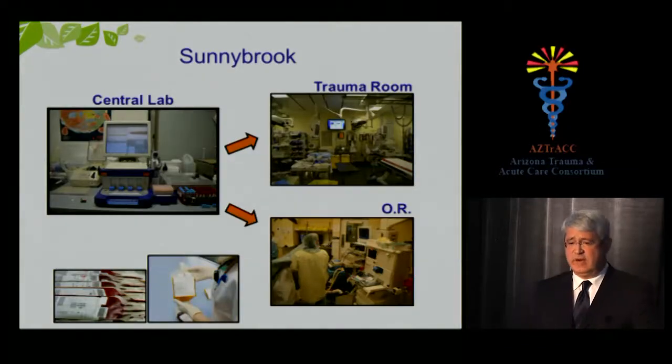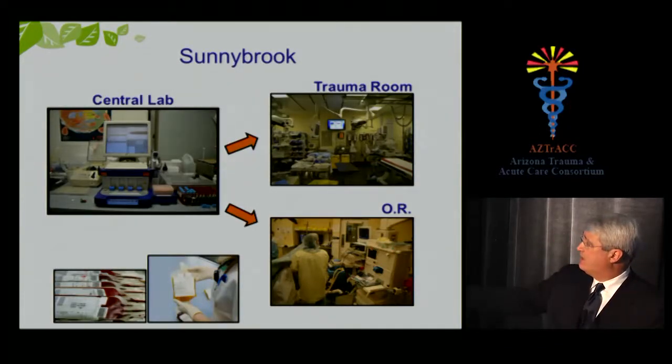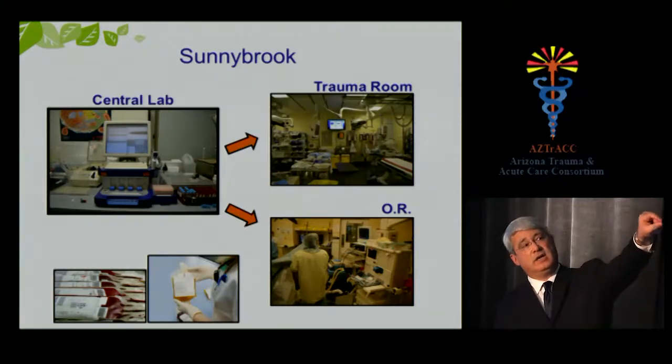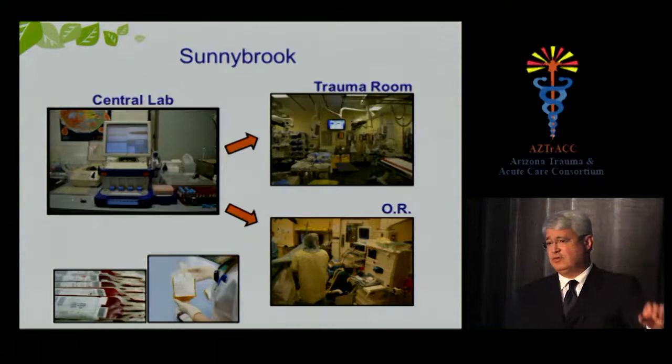And this is the arrangement we have now at Sunnybrook. We have the ROTEM and the TEG in the central lab, and then we have a big screen in the trauma room. So as soon as this machine comes alive, this image starts forming. So you're resuscitating your trauma patient here. All you have to do is raise up your head and look on the wall, and you can see the result going on. So there's no excuse not to use it.